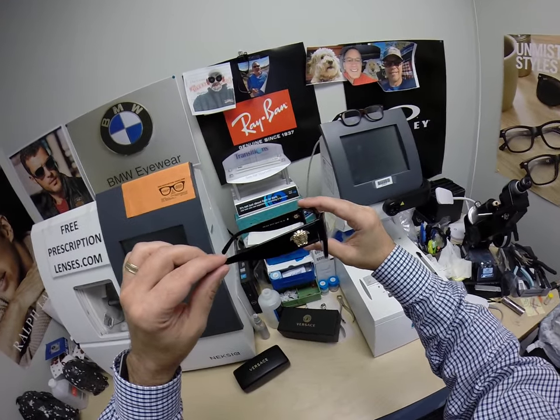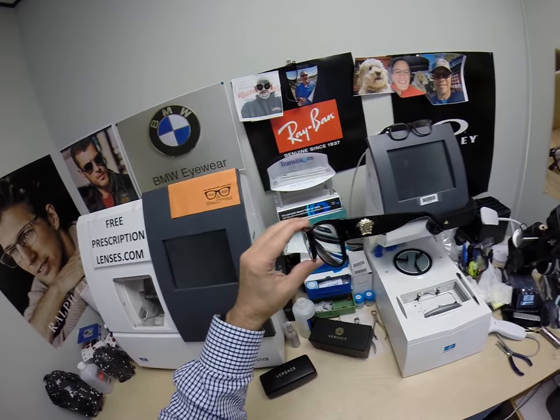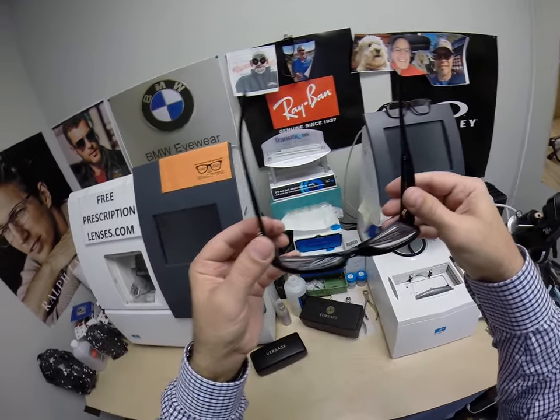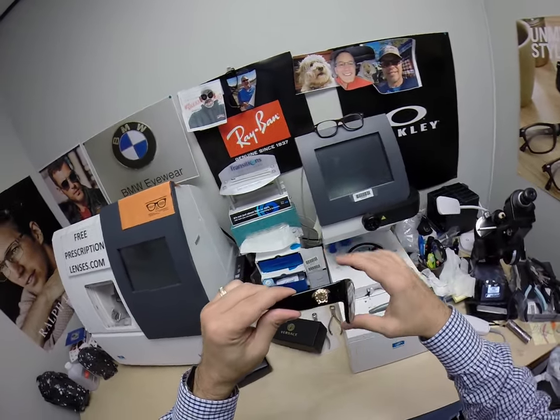This is a fairly strong prescription. The nice thing about this frame is the thicker temple and the thicker plastic block the side view. Nobody sees the thickness of the lens in there — only the top corner, which no one else will see because it's blocked by the temple.